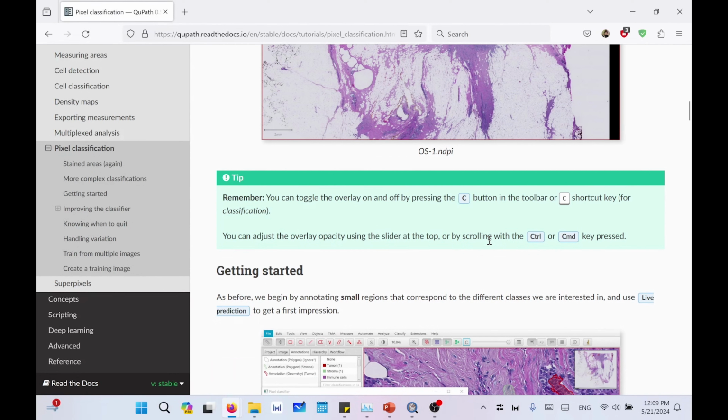So in this lecture, we have dealt with QuPath annotations such as the rectangle, brush, and wand tools, how to create, open, and add images, how to separate between the hematoxylin and eosin stains and other stains, and how to auto-tune the vectors of the hematoxylin and eosin using the stain vector calculations. Then we dealt with cell detection, positive cell detection, and pixel classification. Finally, we learned how to deal with more projects and tutorials from the QuPath website.